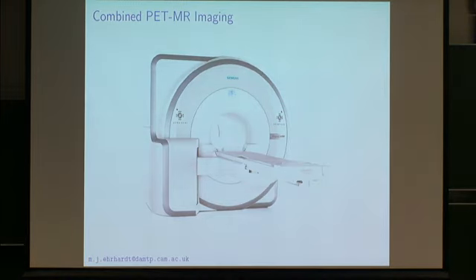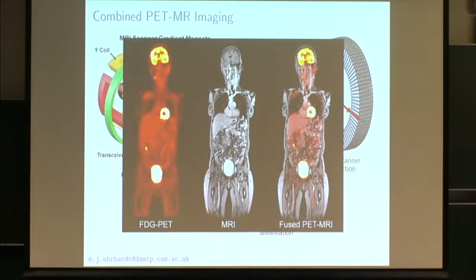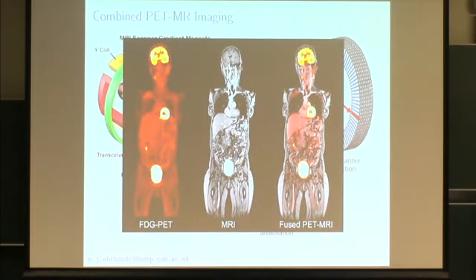And the nice thing, why I got interested in this, is that now we are able to do combined PET and MR imaging, so that we can combine these two imaging modalities into one scanner and acquire PET and MR data at the same time. If you do this and reconstruct from it, on the left-hand side you can see an FDG PET image, and in the central column you can see a structural MRI image. What usually is done is that these modalities are then combined on the image level by, for instance, overlaying them or doing statistics on them combined.